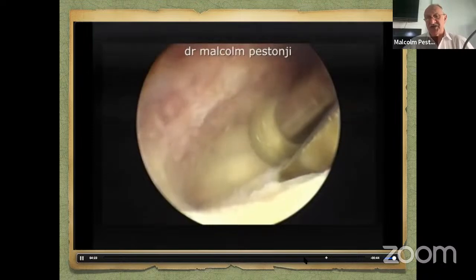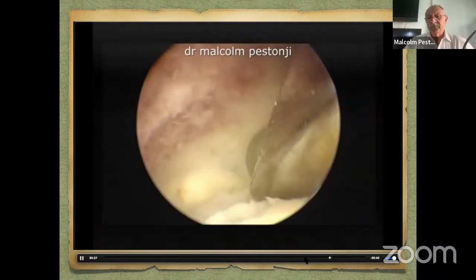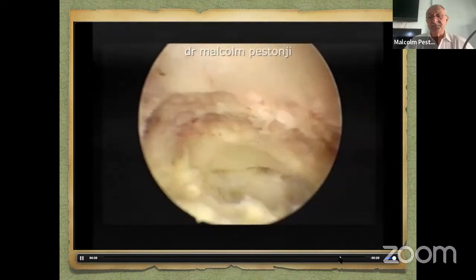I've come to that junction. We are going without pushing. Now at that junction, we are decompressing the lateral side. You will see that I will be entering the opposite foramen.